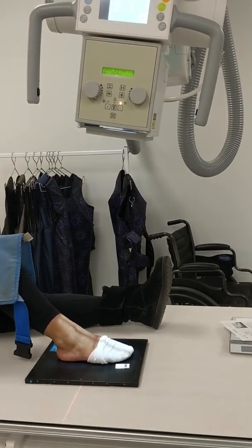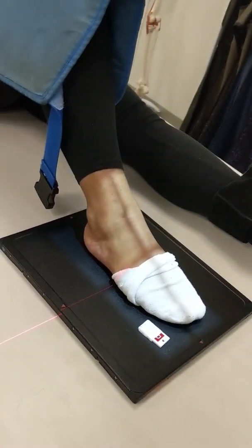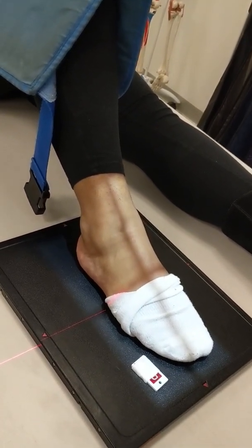Okay, so here is the AP foot. We've started with a 10 by 12 lengthwise. We've aligned her long axis of her foot with the IR. We've got a right marker on the lateral side. Our CR is placed at the base of the third metatarsal.